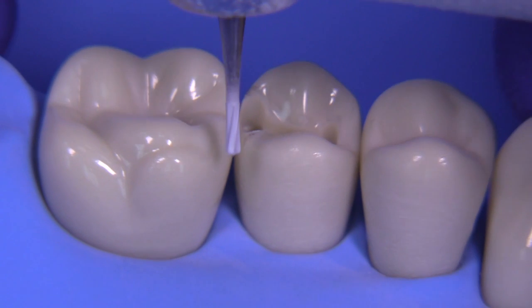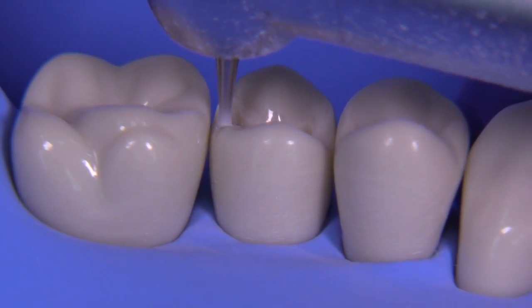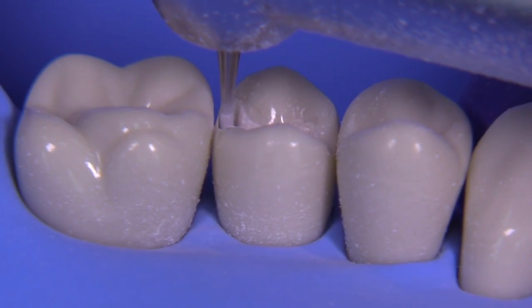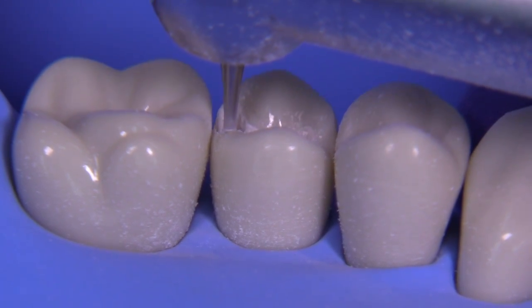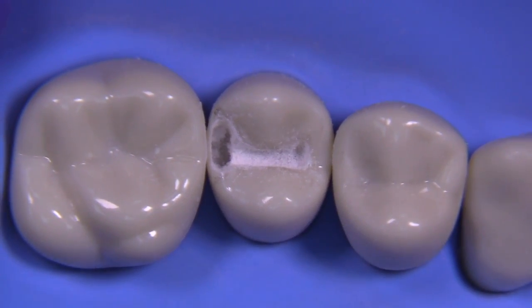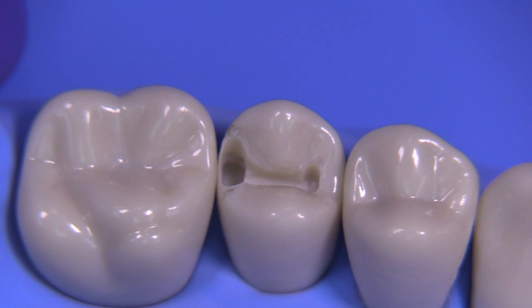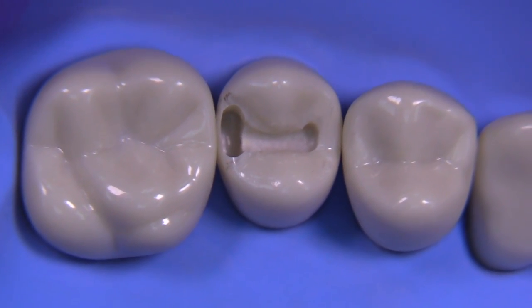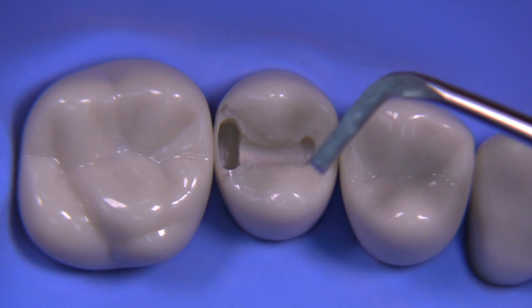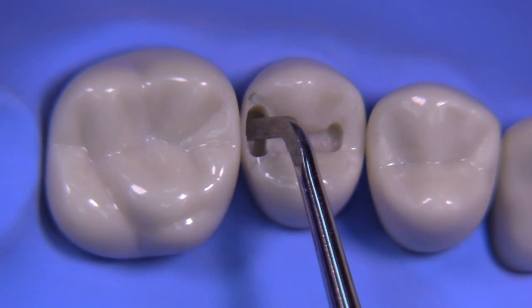Even though we've dropped the burr down quite a ways, we still haven't broken through the gingival. It's really common on Columbia dentiforms that the contacts are fairly tight and sometimes long occluso-gingivally, so you need to keep extending the burr further. There is no standard measurement for the height of the axial wall. The axial wall height will be determined by two factors: the contact, which we need to break, and the depth of the pulpo, which should be 1.5. So after we break the gingival contact and we have 1.5 pulpo depth, the axial wall height will be whatever it's supposed to be — it may be a millimeter, it may be four millimeters — it all depends on where the proximal contact is located.